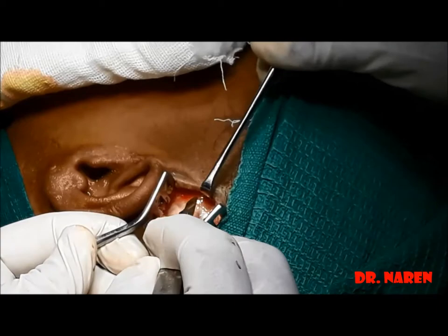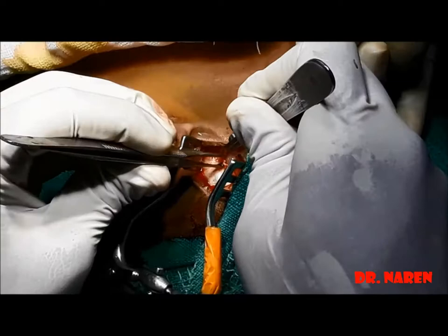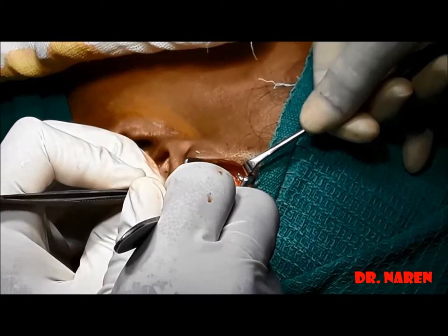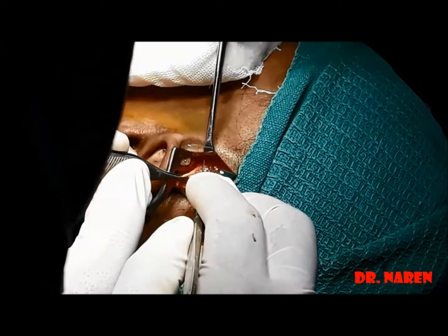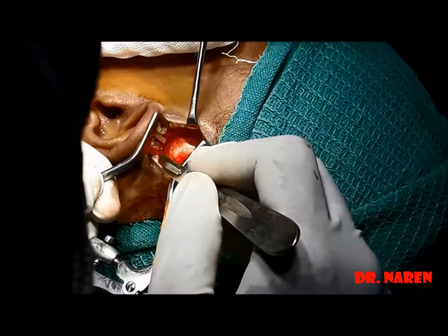Usually the inferior half centimeter of the temporal fascia is too thick for immediate eardrum reconstruction, so the inferior incision through the fascia should be made about 0.5 centimeter superior to the lower attachment of the muscle, leaving the thick strip of fascia in place. If the fascia is to be used as a larger piece for eardrum and ear canal reconstruction, the thick strip is excellent for reconstruction of the ear canal.